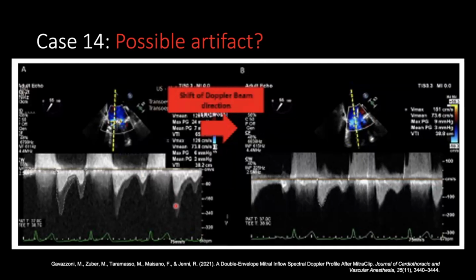Yes, we've seen it with native mitral stenosis. Right. I think you and I. Yeah. Sorry. I've not seen that with a native. I think someone did it at pressure. Yeah, pressure recovery in the aortic valve. That's also, I've heard, I saw some paper on that as well. Some people think it's pressure recovery. But if anyone on the call has more thoughts on it, please feel free to share.